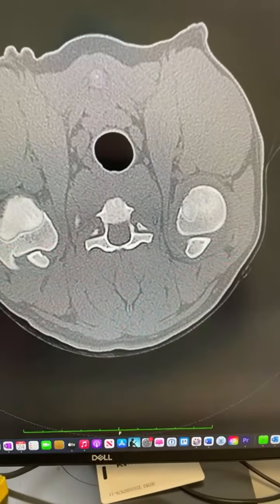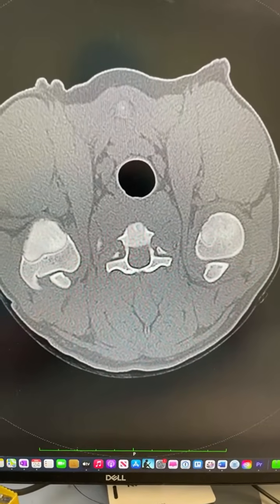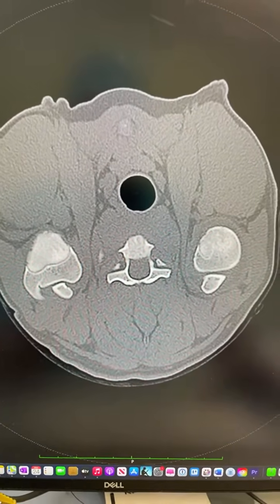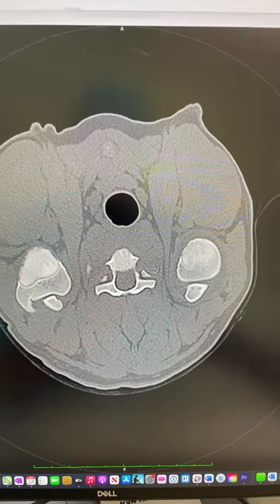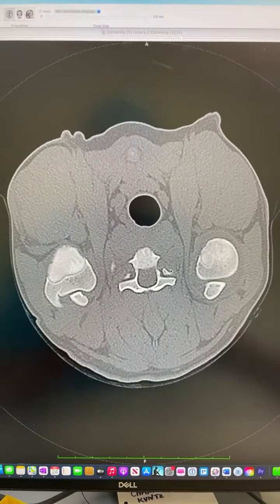This was a 6-month-old Kelpie that presented with a history of a left forelimb lameness. It was exacerbated by jumping up on the owner one day and has persisted since then, intermittently responsive to anti-inflammatory medications. On physical examination, it was very sore in the left shoulder.